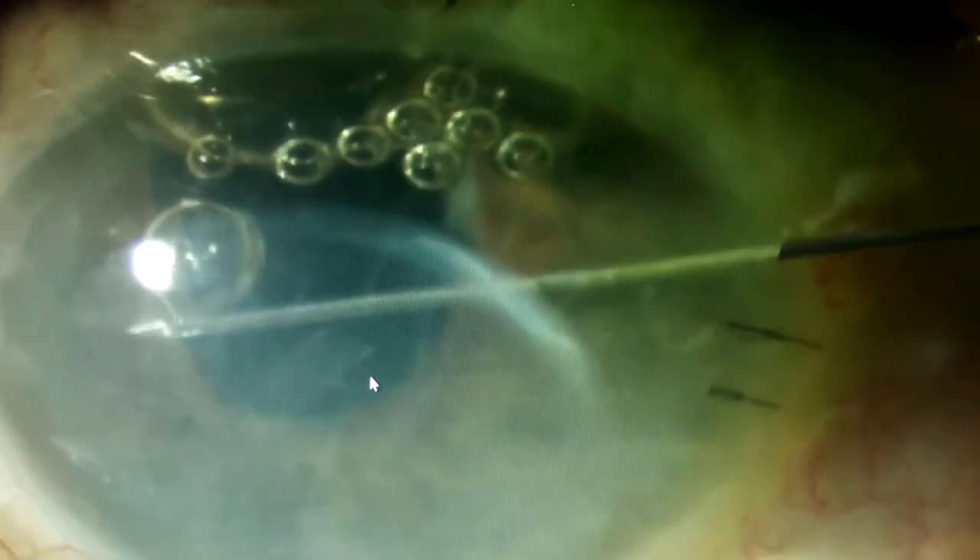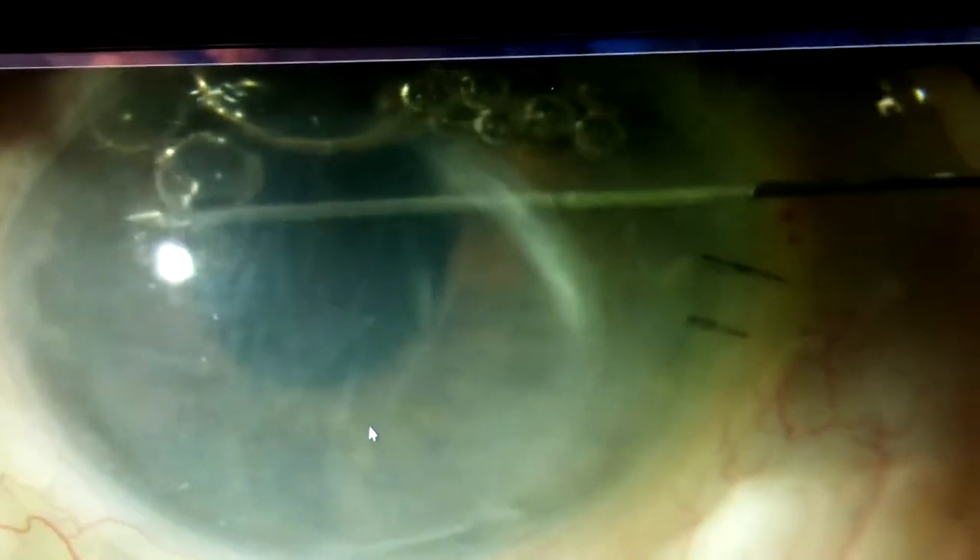Doing a DSAEK procedure in the presence of one, two, or three tubes is always fun surgery. The big problem is that the air bubble escapes out through the tubes, causing the graft to de-center in the immediate postoperative period and necessitates refloatation.